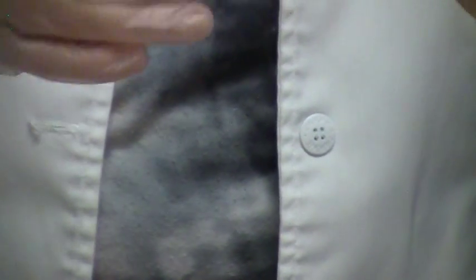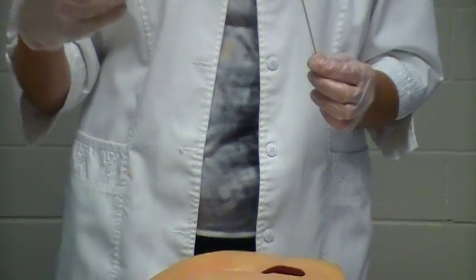Now some facilities will require you to measure those tunnels. And if they do, make sure that you follow those guidelines and measure them appropriately. For today's skill, I am not going to show measuring the tunnel. It would be done the same way that we would measure the depth of the wound. You would just document where the tunnel is located. You would say tunnel at 1 o'clock. And if the facility requires you to measure that tunnel, then you would document what the measurement of that tunnel is at that time.